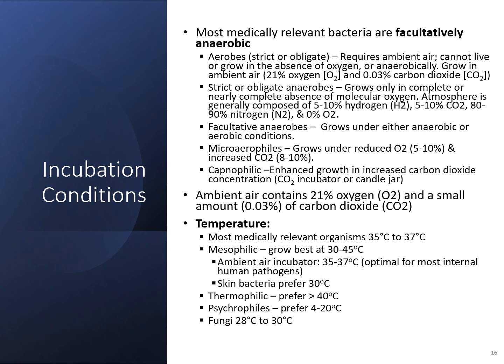So depending on which organism or pathogen you're looking for in a particular sample will depend on where you actually incubate those agar plates. If you're looking for an aerobic type organism, these are incubated in ambient air, so this would go directly into the incubator with an oxygen of about 21% with a very low CO2. Your anaerobes cannot grow in the presence of O2, so those would go into some sort of anaerobic bag to prevent any sort of exposure to O2.